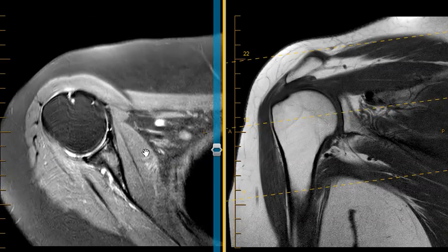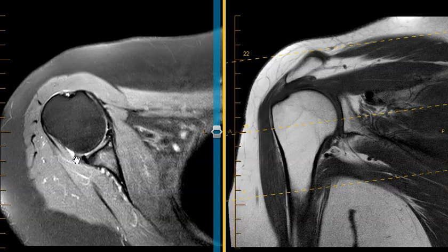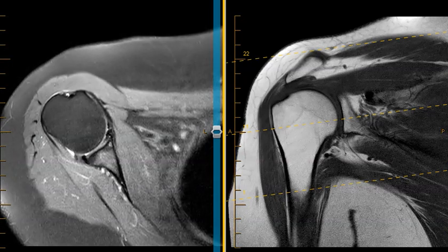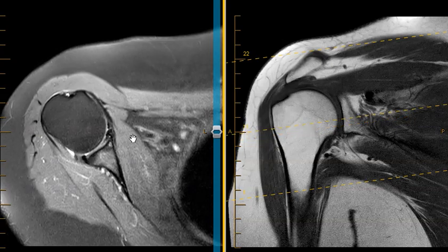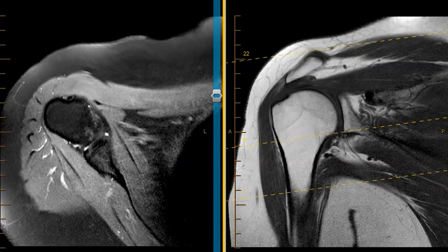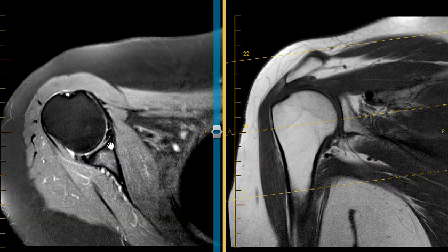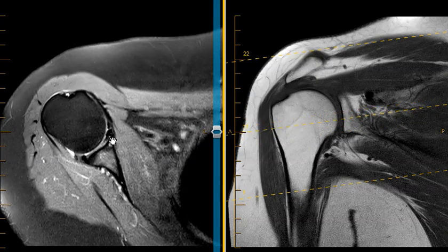They had one other finding related to their labrum. On this view, we see the glenoid here — the cup from the scapula — and the round ball of the humeral head. We see the biceps tendon right here. In the front, we see a little black triangle — this is the labrum that goes around the rim of this cup. There's abnormal signal in the anterior labrum, very subtle, barely discernible — it should be just perfectly dark. There's a little linear band of brightness, so it looks like a little labral tear. The bone underneath has little bright spots — there's a little subchondral erosion that goes along with that labral tear. They also had a little blip of fluid right there — that little white dot — that's a paralabral cyst. When a torn labrum occurs, fluid can weep out of it and form a little fluid pocket, which we call a paralabral cyst. So the patient has a tear of their anterior inferior labrum, very subtle.